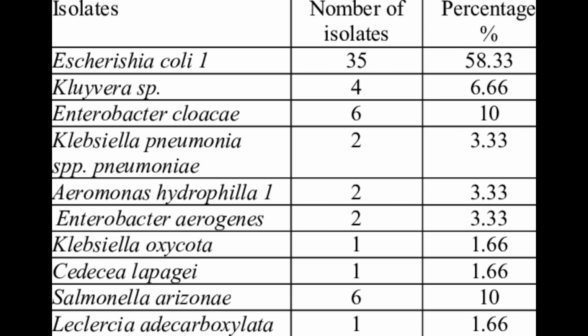Now let's go with the last one, actually, the malonate utilization. It detects whether the enteric can utilize malonate as the only source of carbon for metabolism. Their medium is malonate broth, which has bromthymol blue as pH indicator, just like SCA.